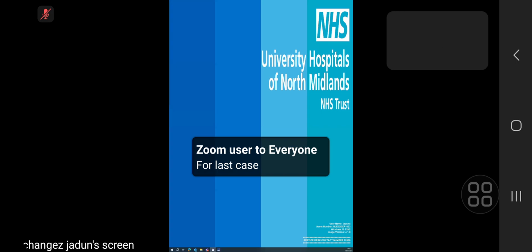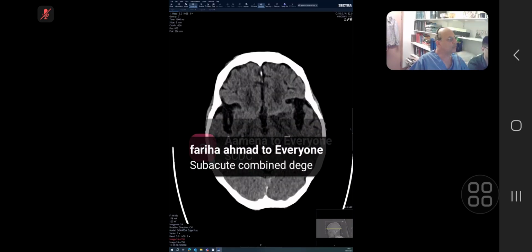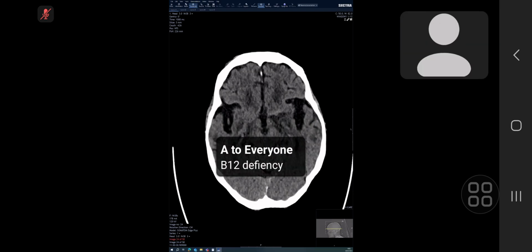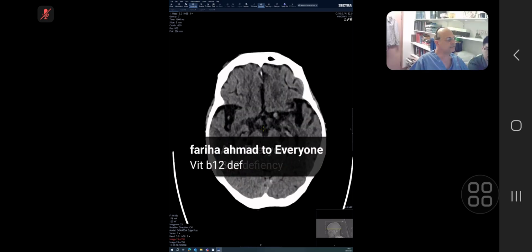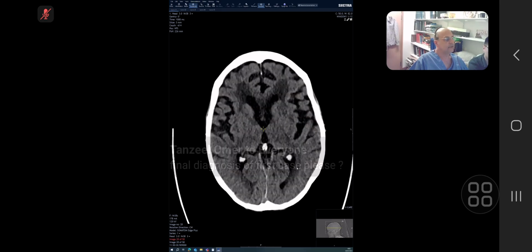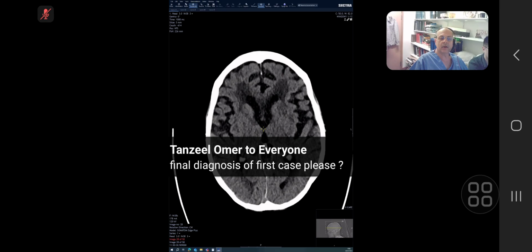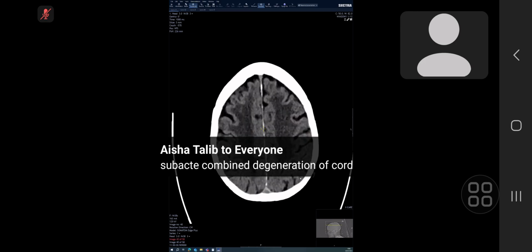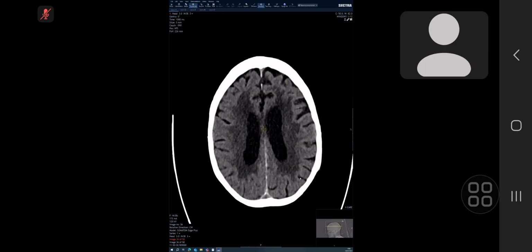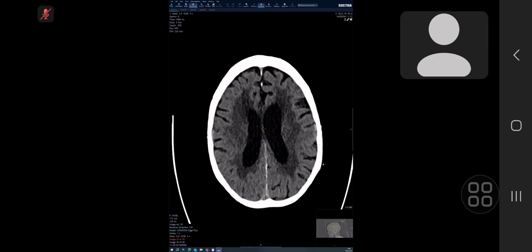Okay, so this is a patient who came to us with unwitnessed fall, loss of consciousness, bilateral orbital bruising, query nasal fracture, hypertensive, low heart rate, rule out intracranial complications. I'm reading the exact history. So I'm going to start from the top. Okay, sir.